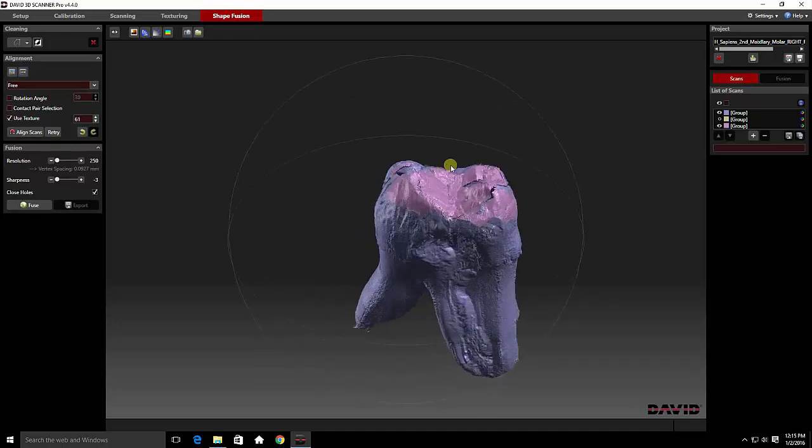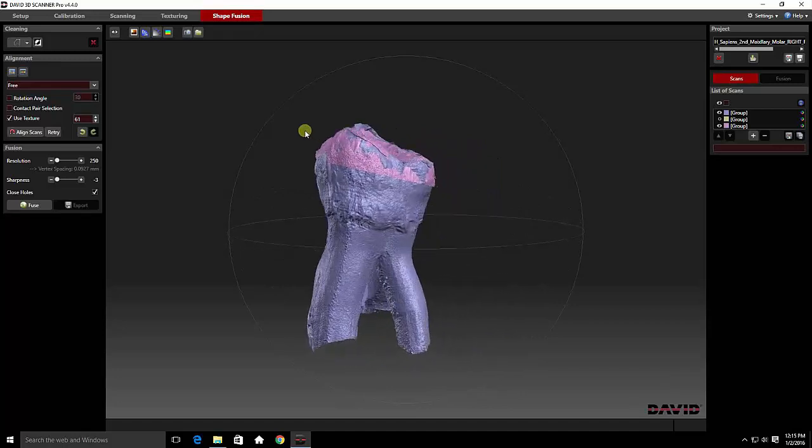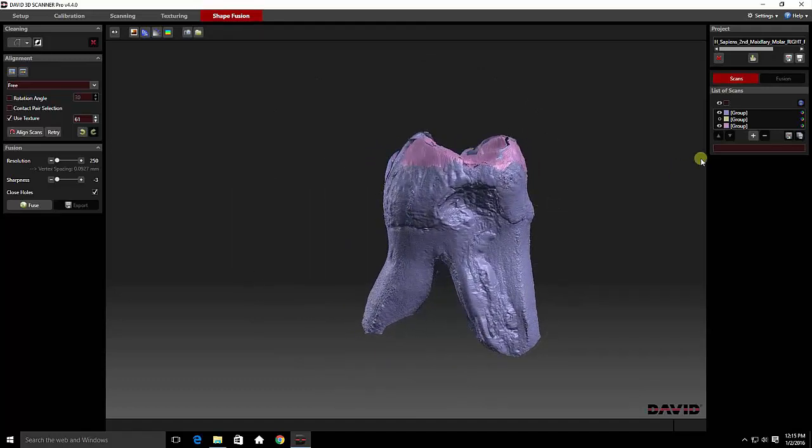Now we want to clean up these two sections. We have a lot of extra information coming through from the purple, and we don't need all that information. Pay attention to the line where the pink is. Turn off the view of the purple, turn it back on, then turn off the pink. You can see you can cut off the top of the tooth right there, and that's exactly what I'm going to do — just to bulk get rid of unnecessary information.